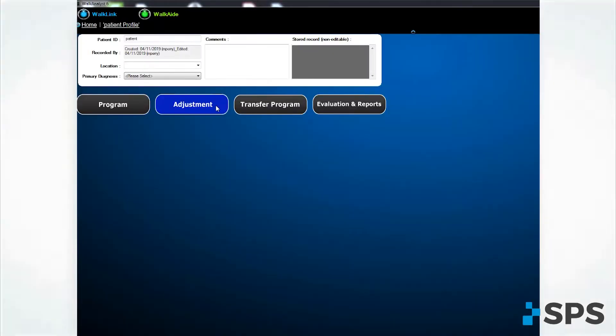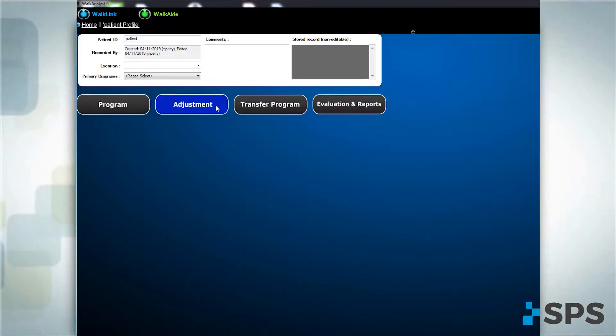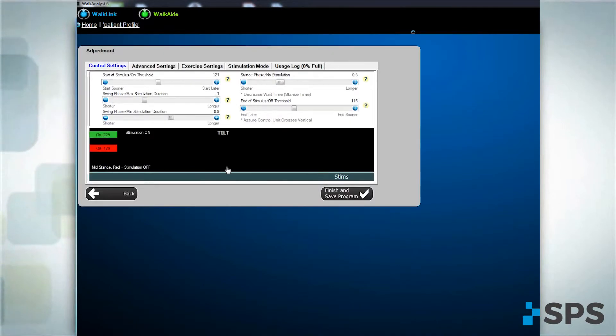If the patient misses stimulation with any steps or if the stimulation timing is not right, make adjustments on the adjustment screen for control settings.